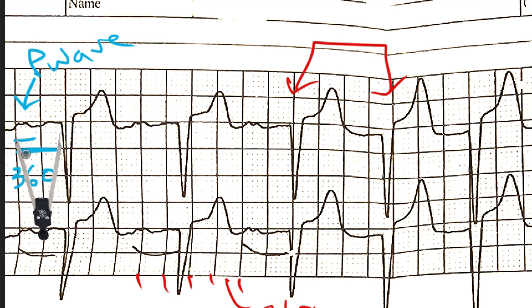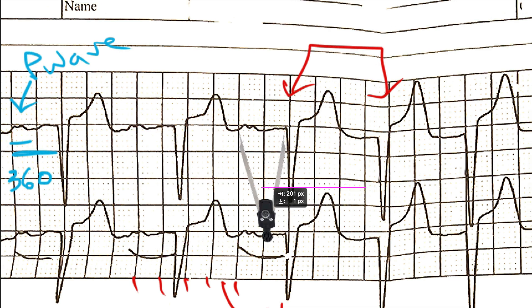At this point I set the calipers for this PR interval and we're going to look at the next beat. That PR interval looks to be the same, still around 360 milliseconds. And then when we look at the third beat, again we have a nice P wave with a stable PR interval. So you can say that's normal sinus rhythm at 68 beats per minute with first degree AV block.